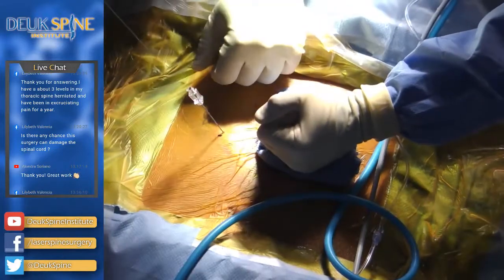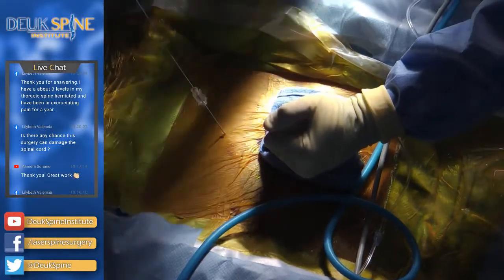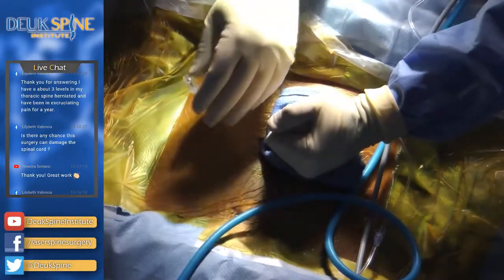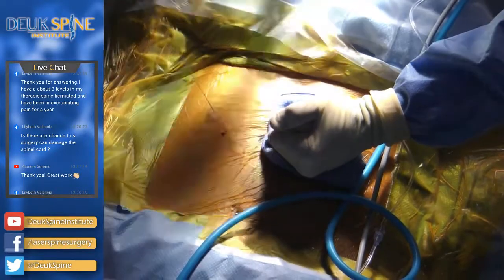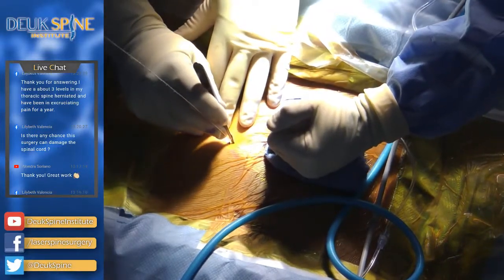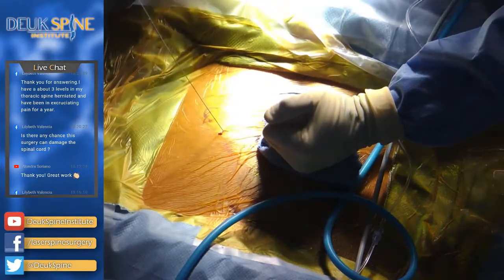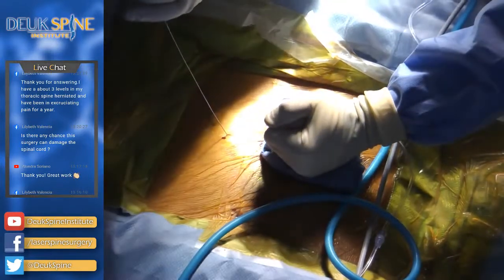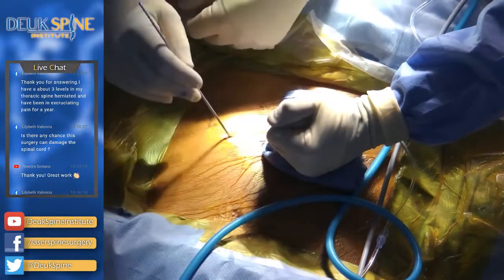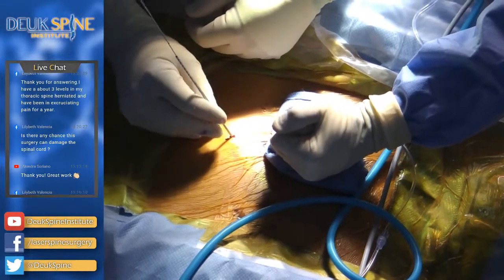We've already placed my needle. This is my safety path shot. So now I'm going to remove the needle. Make sure the guide wire is still there. It is. And then I'm going to use the guide wire to safely enter the disc herniation. By the way, one of the nice things about this surgery is, quite literally, I go into the disc, not in a normal part of the disc like you would with an ACDF or a thoracic discectomy. I go in right through the tear. That's the bad part. So we're entering the disc in the part of the disc that's already damaged. So we're not creating any collateral damage.